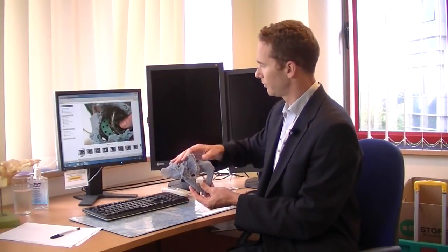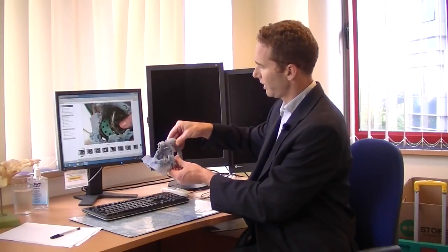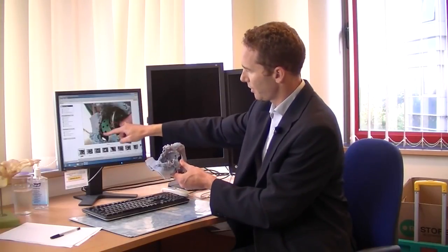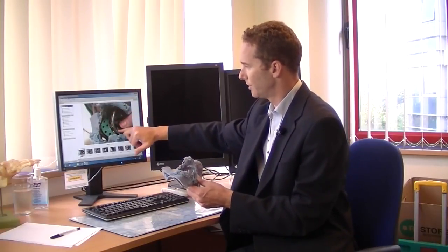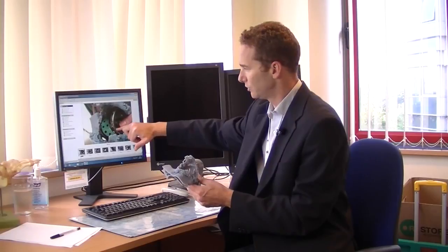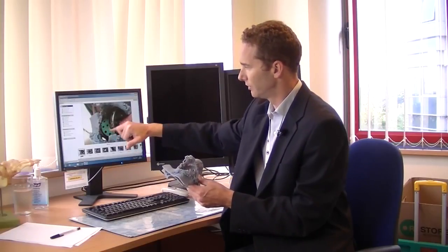So this is the same model that you can see here, turned this way, and these different components you can see are all different pieces which would represent metal that I can use to build up where the bone loss is to create my hip component that would then finally fit in, which would rest on these metal components to allow a good, solid, stable fixation.